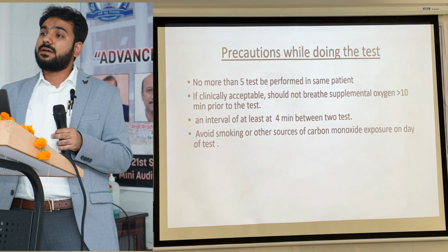If the patient is a smoker, ideally the best thing will be to abstain from smoking for 24 hours, but for smokers that can be a very big duration. So abstaining from smoking for 5-6 hours before the test should do fine with us. If we smoke, it will lead to a raised level of carboxyhemoglobin in our blood, that will give us a back pressure and that will ultimately affect the values.